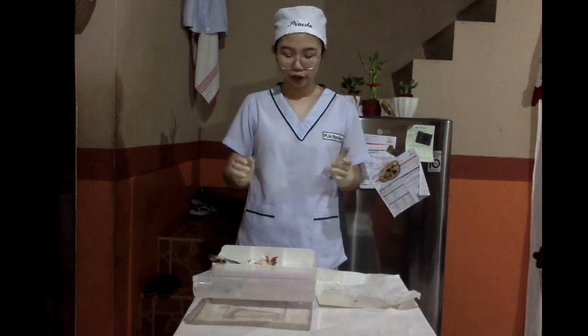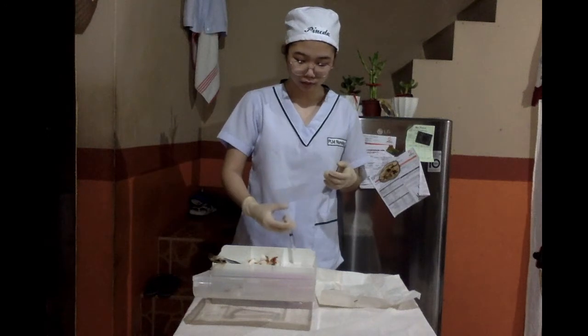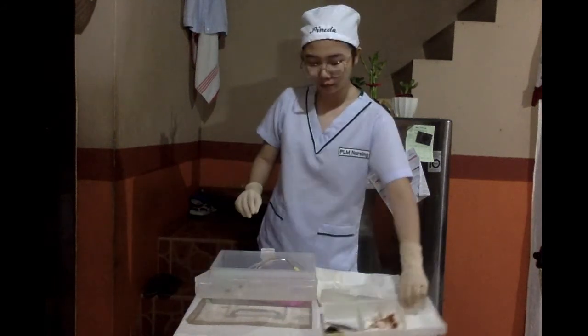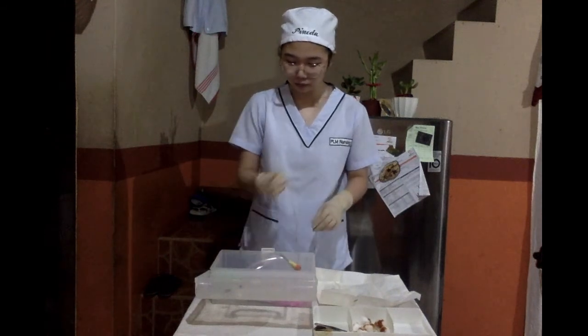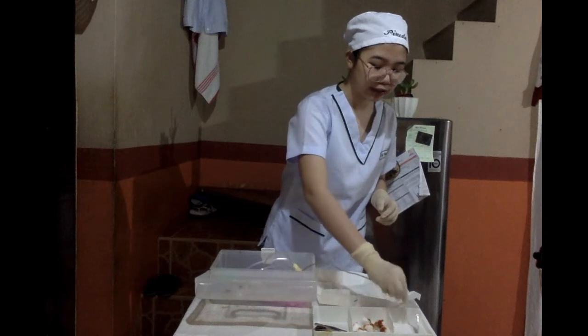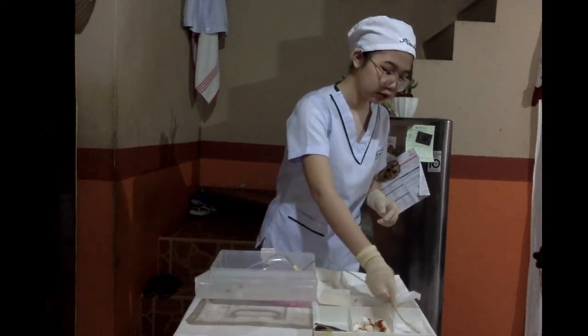Now I will pour out the lubrication jelly out of the syringe. I will now examine the catheter tip. The catheter tip is intact. With that being said, I will now lubricate it with the lubrication jelly, 3 to 4 inches of the catheter tip down.